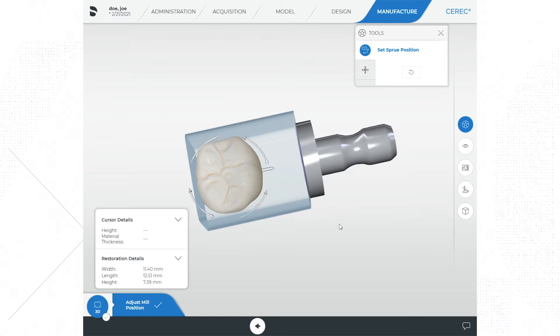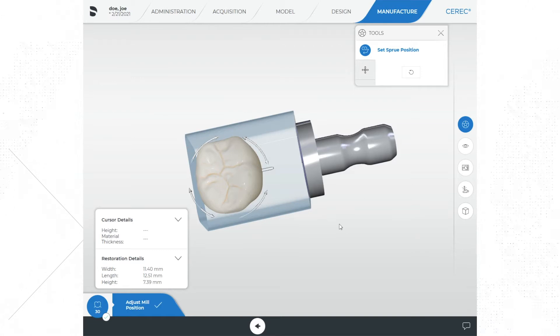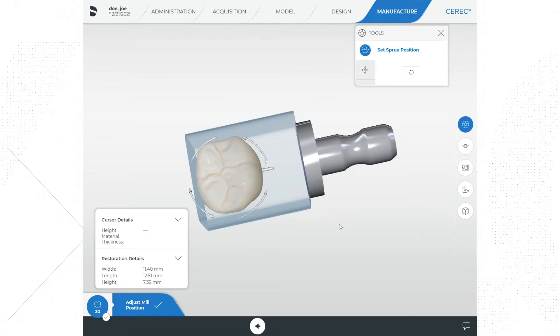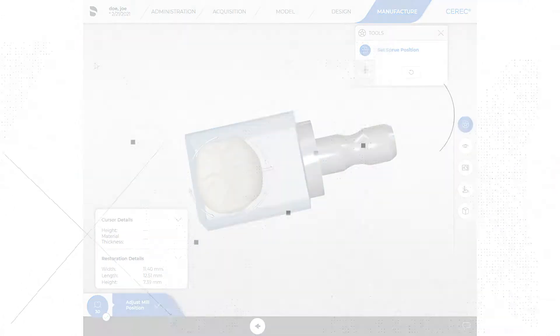At this point we are ready to start milling. Be warned that when milling you should be aware that you may see milling errors such as wrong block size, water level low, or worn burrs. We have some separate videos that show you how to deal with these milling errors so that you can get your restoration finished and in the patient's mouth.